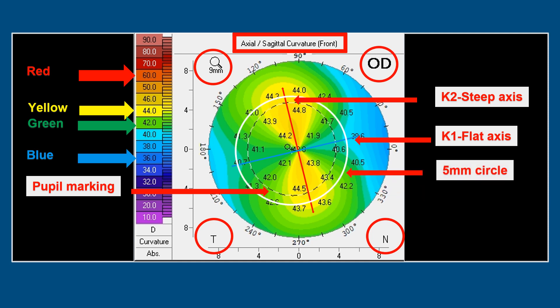There is also a 5 mm circle on the map, which is important. When interpreting the topography map, we compare the superior and inferior values at the 5 mm circle. For example, the superior value here is 44 diopters and inferiorly it is 43.7 diopters. This 5 mm circle is important for the interpretation of the topography map.